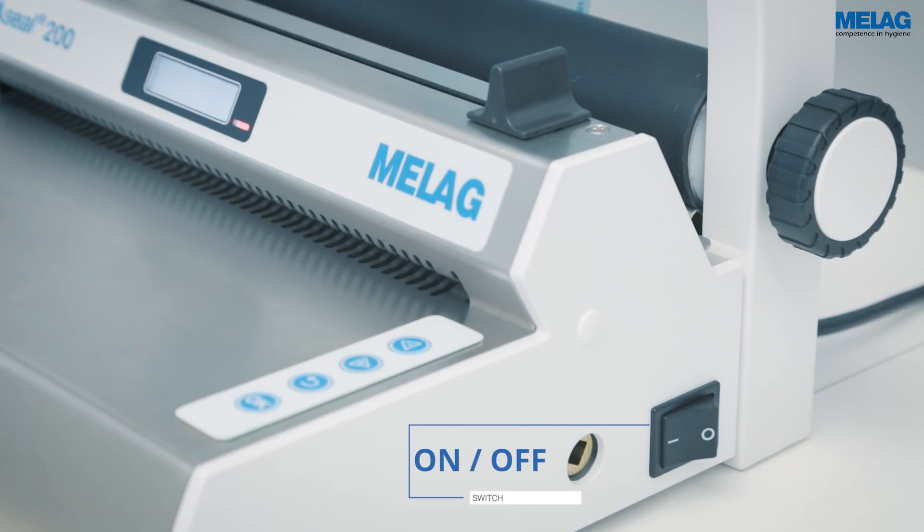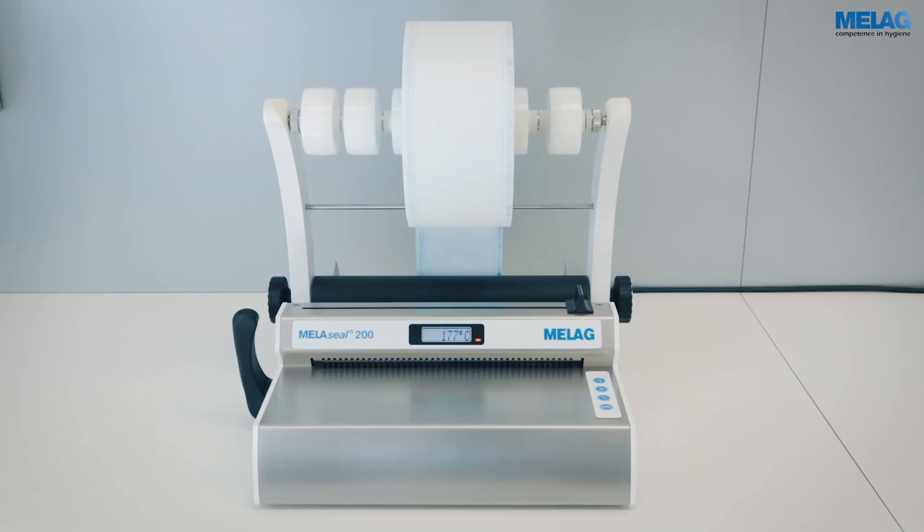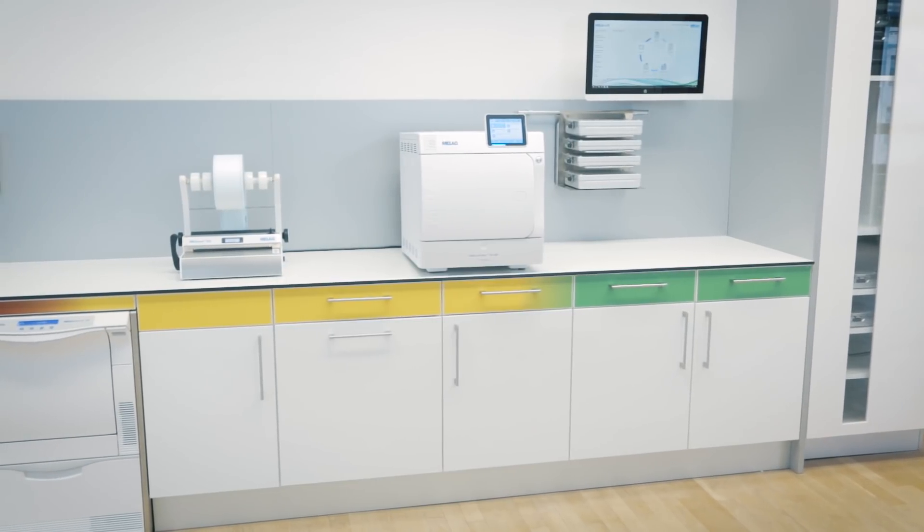The LED will illuminate orange after the MieleSeal 200 has been switched on. The set sealing temperature of 180 degrees will be reached within 90 seconds. The sealing device is ready to operate as soon as the LED illuminates green and the display shows ready.